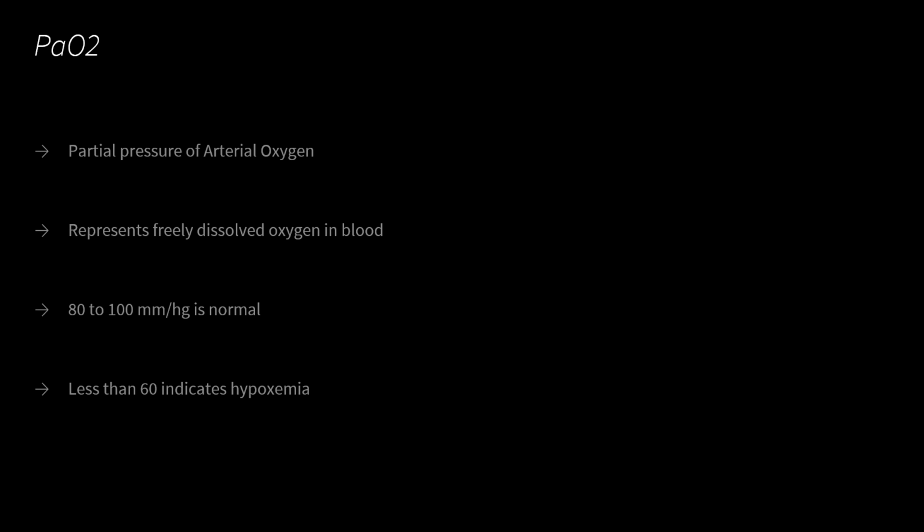And again, it's measured as a pressure, so it can exceed 100 and it can be lower. Less than 60 typically indicates pretty significant hypoxemia, and anything over 100 would be diagnosed as hyperoxia.